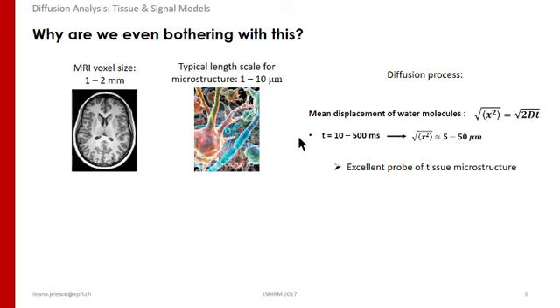So I'll be talking to you today about how to analyze the featureless signal that we get from PGSE that Dr. Nelson just described, because this is what people usually acquire, and it's still nonetheless important to try to extract the most information out of it.